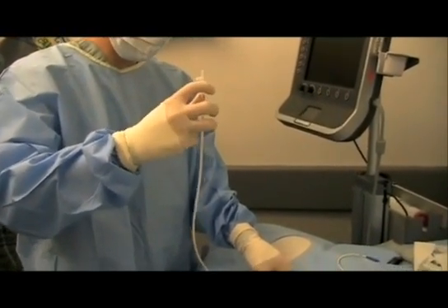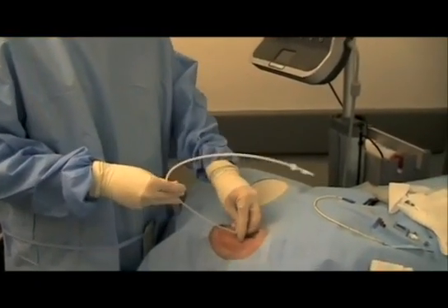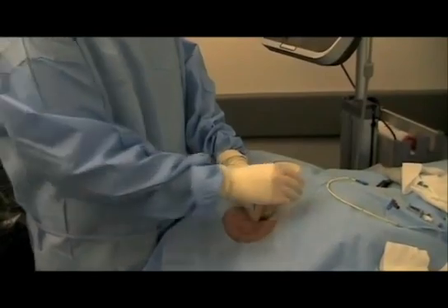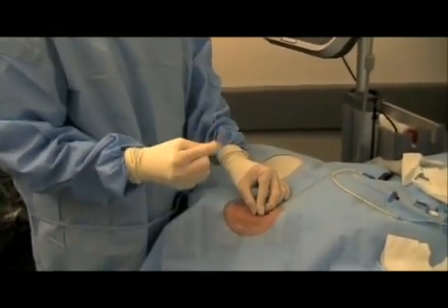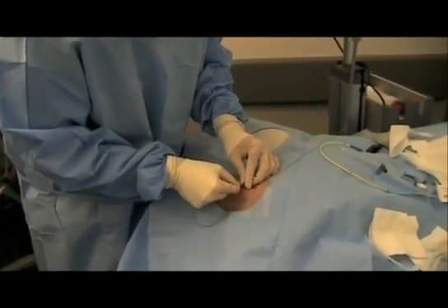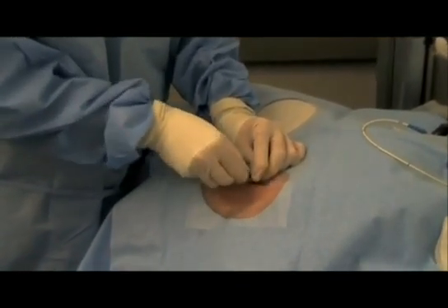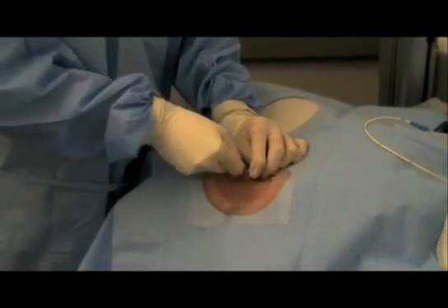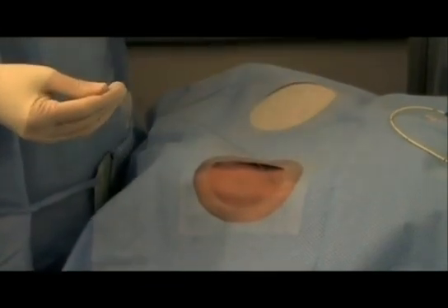If on the other hand you see that column of blood actually flowing back towards your catheter, you're in a vein. At this point you can take off your extension set or wire sheath, re-thread your wire, take off your angiocath, and just finish your line procedure just like you originally planned. At this point you dilate and finish off your line.